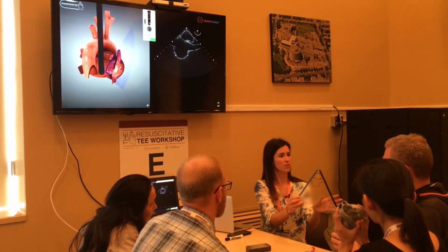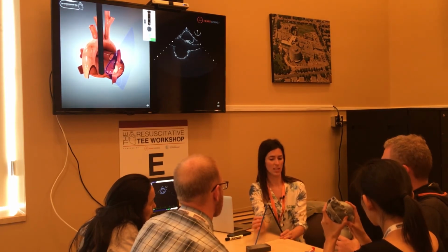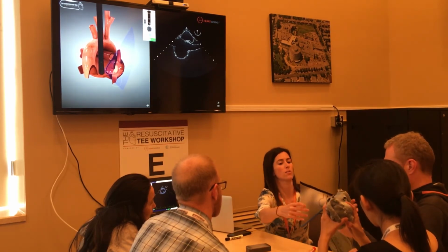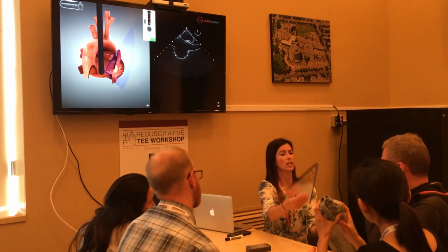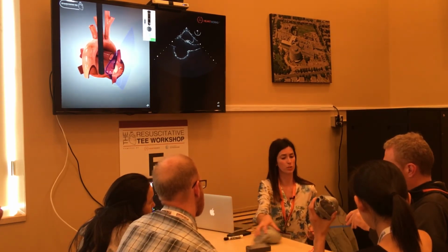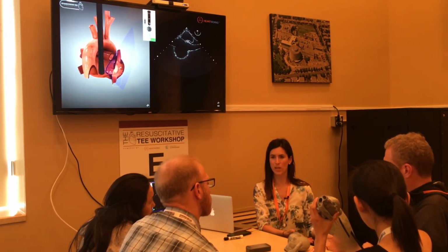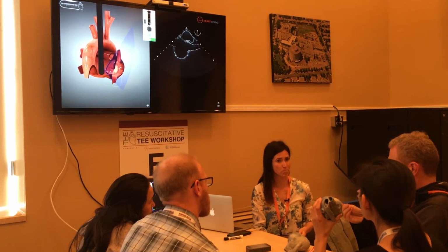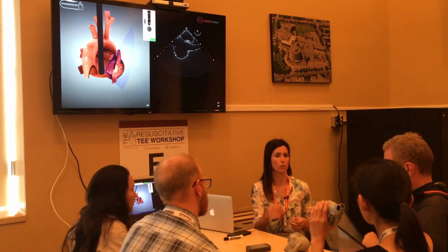All right. Can you tell me which is the SVC? Perfect. And then the IVC. Exactly. So you have rotated 90 degrees, right? And it's great because we get this right in line here. SVC, IVC. Okay? Now, if I want to see more of the IVC, what am I going to do? Push the probe down. Just advance the probe. If I want to see more of the SVC, what am I going to do? Exactly. So we don't need any flexion with the probe, it's merely advancing or withdrawing the probe.